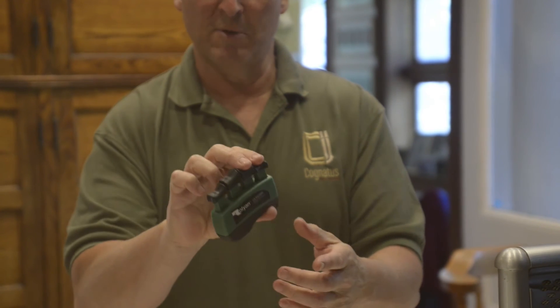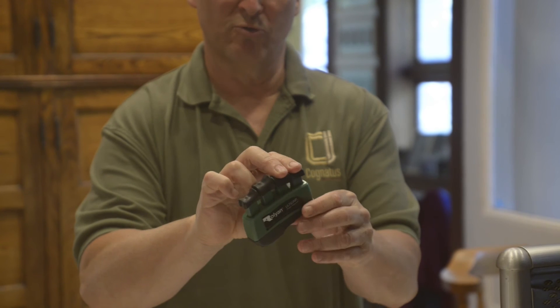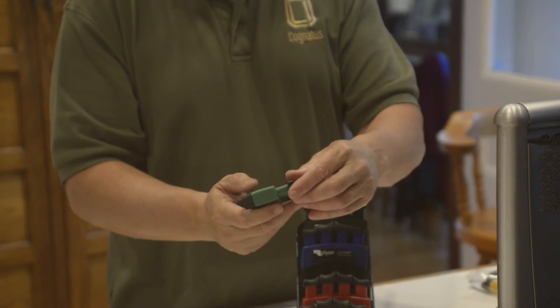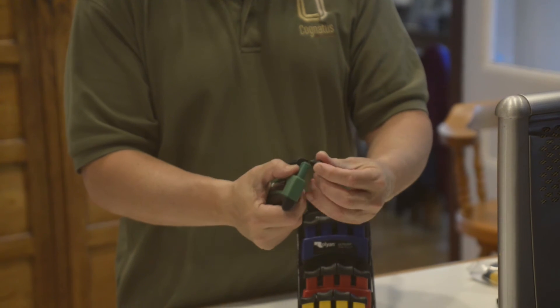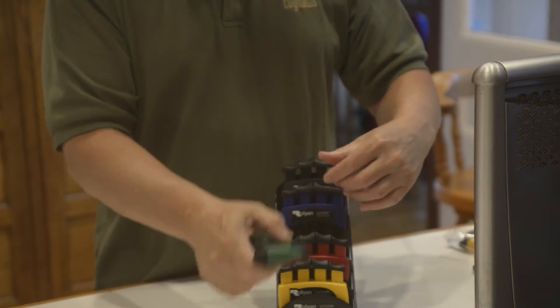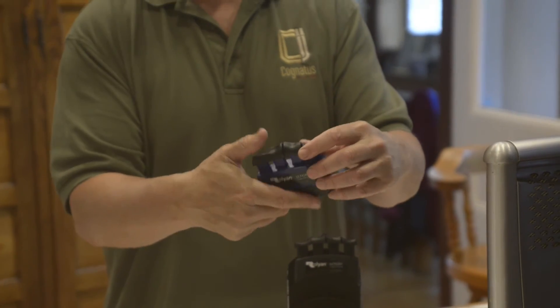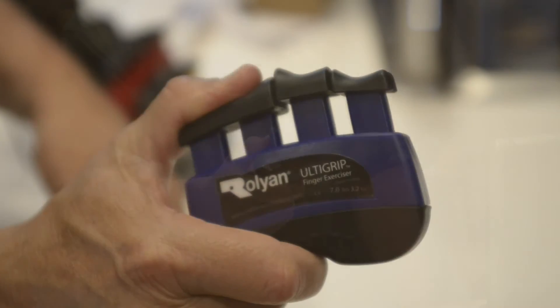If you're doing a three-point pinch or two-point pinch, you can use the groove here or the groove here. These tips also come off very easily, and there is a thumb adapter which fills two plungers — so if you're doing thumb flexion, you get the advantage of both.